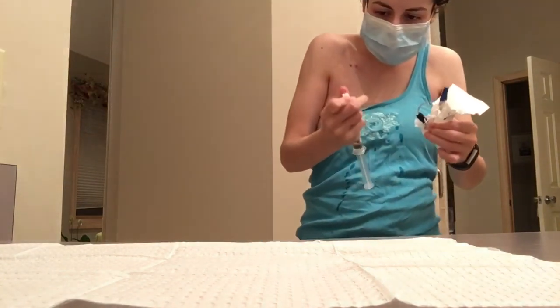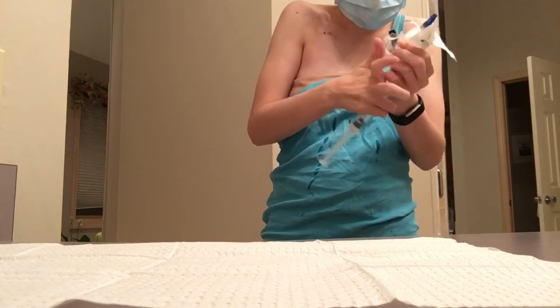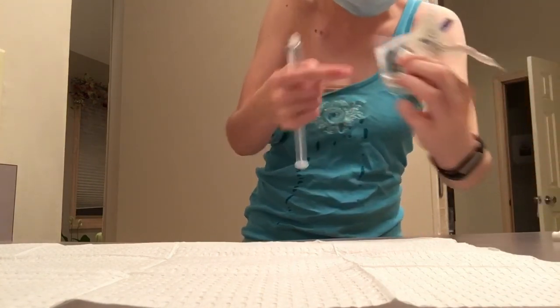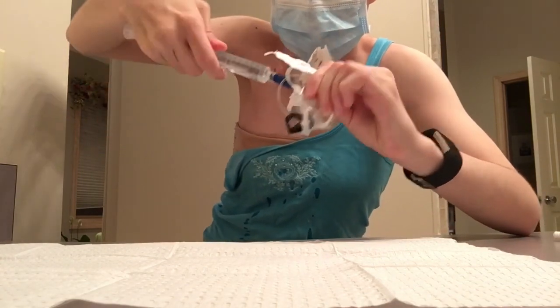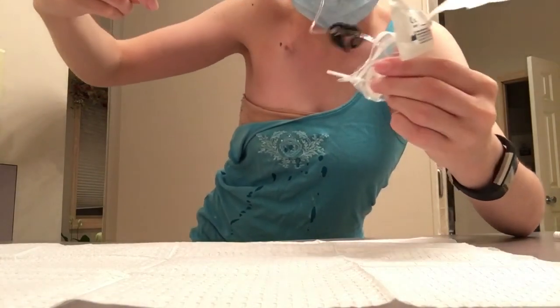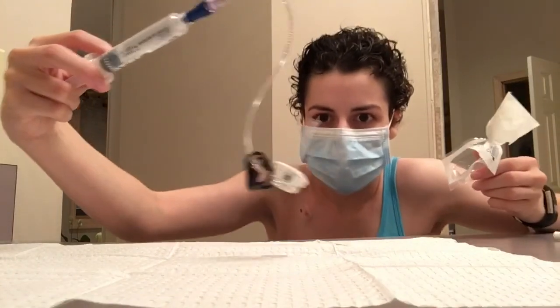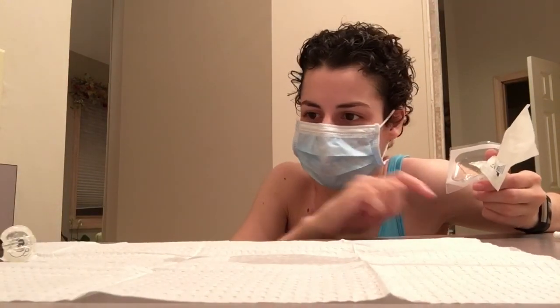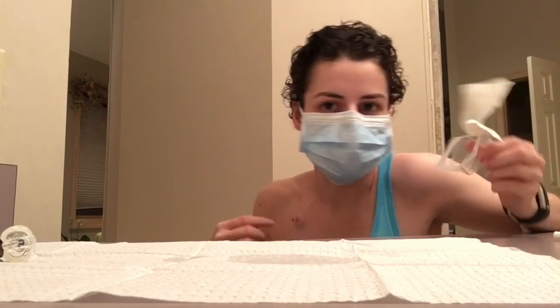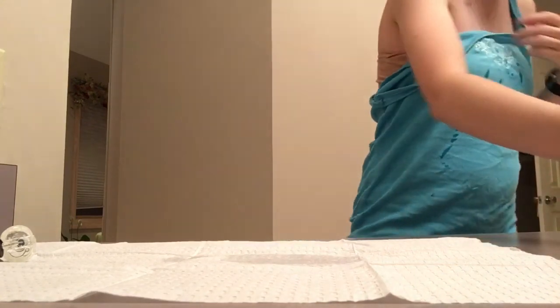And I'm gonna wait and not drop it on yet because I have saline and I can't put my gloves on yet. And this packaging, the inside is sterile, so that's how I can hold that. And then I can just attach this without touching it and then flush it. Now I can let this go, right like that. And then sit this on the edge of the sterile field and then pull just the end. So my needle is primed, and I just held the outside so I wasn't touching anything inside.